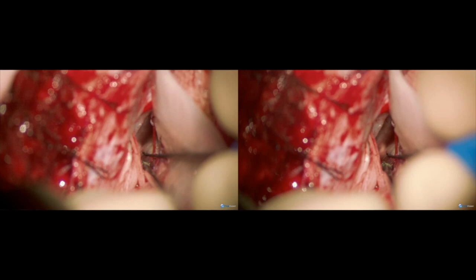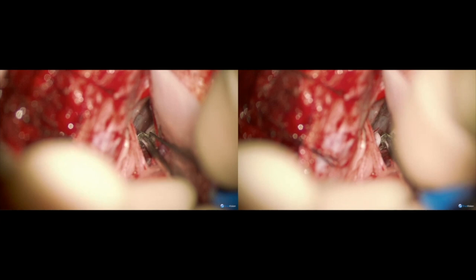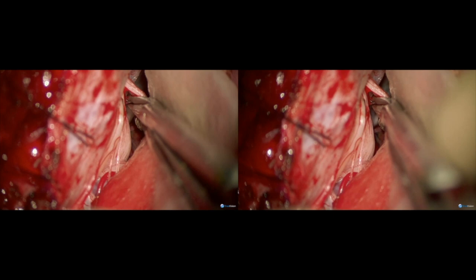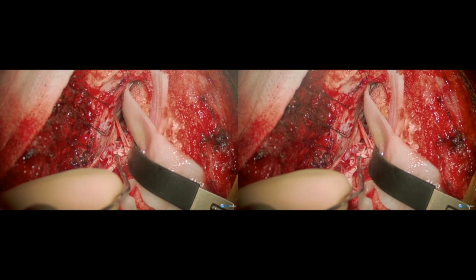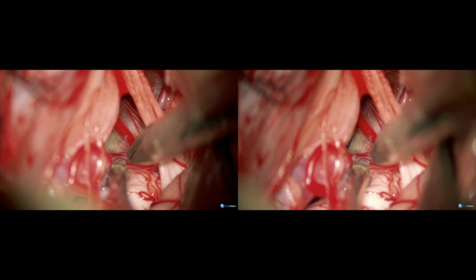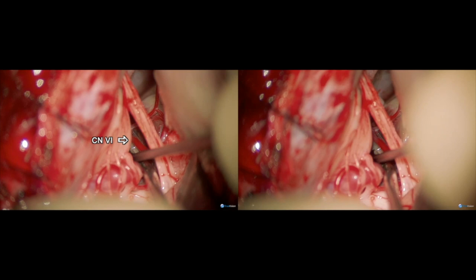The surface of the pons is stimulated to confirm the absence of corticospinal tracts. It appeared that a window under cranial nerves 9 and 10 would provide a better trajectory to the cavernous malformation at the pontomedullary fissure. After the arachnoid adhesions are dissected, a retractor is placed to retract the tonsil and enhance the exposure. AICA branches are dissected and mobilized from the pontomedullary fissure. Eventually the origin of cranial nerve 6 comes into view, marking the lateral border of the pyramids and our medial border of exposure.